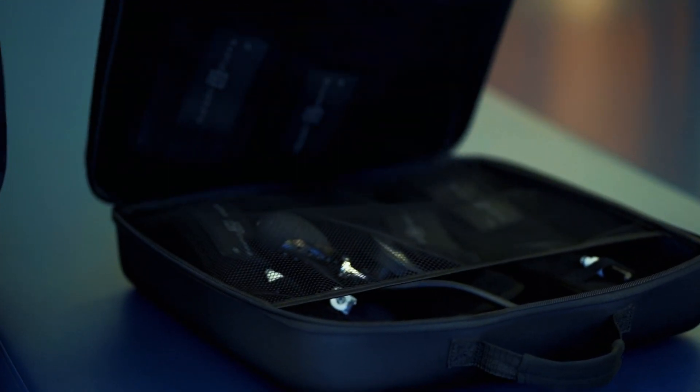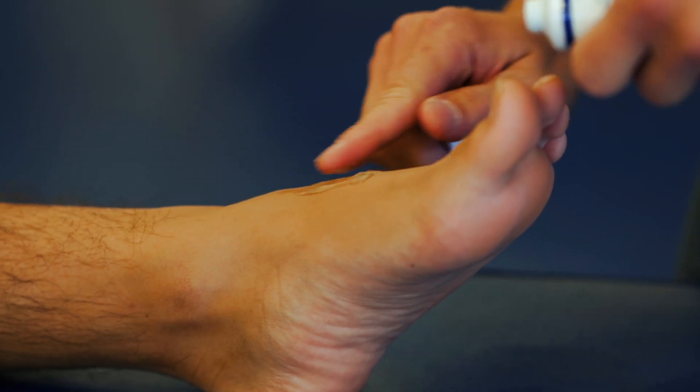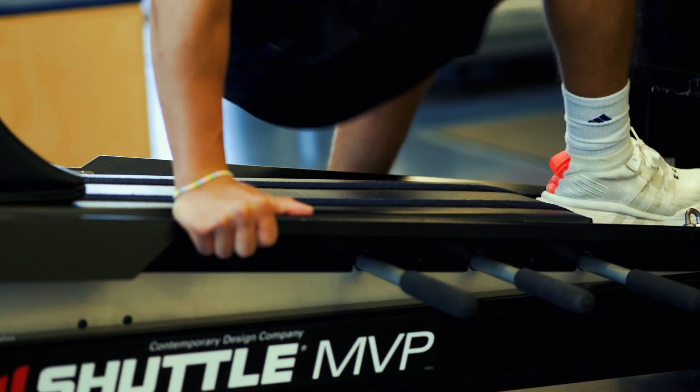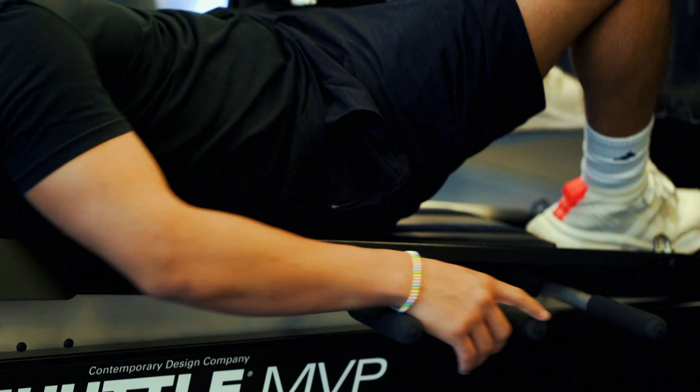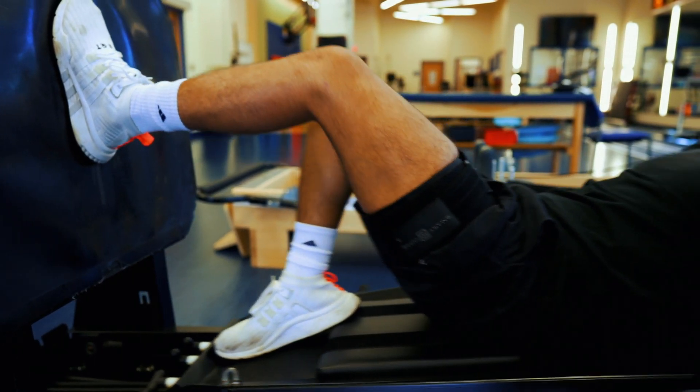In order for a patient to receive BFR training here at Children's Mercy, they'll go through an evaluation with their physical therapist. After a few sessions, the therapist might determine that BFR is an appropriate tool for that specific patient. The patient has to demonstrate tolerance of all strengthening exercises up to that point before increasing intensity.